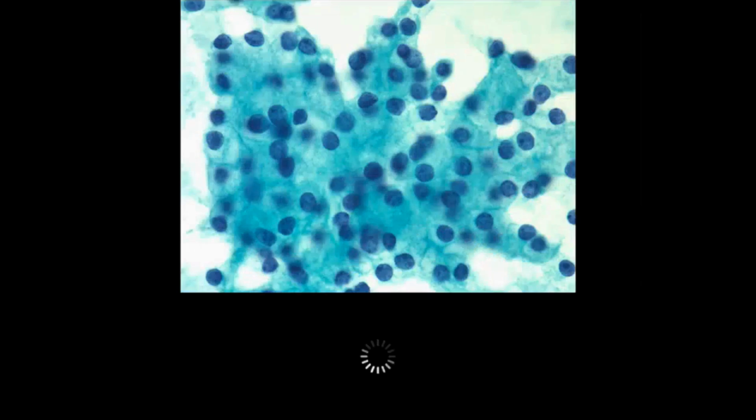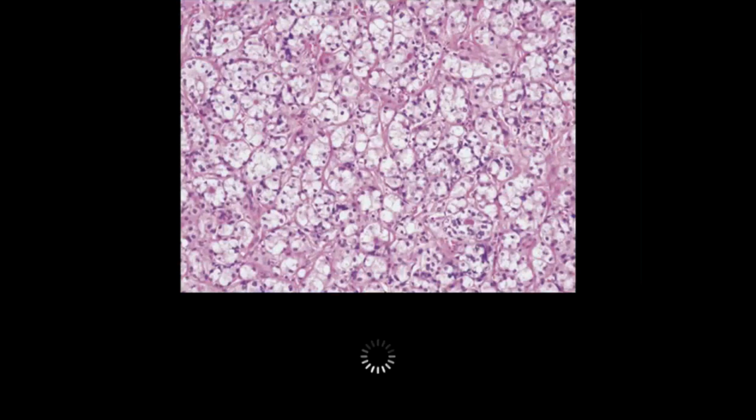And here we can see the papilloid groups of the atypical epithelial cells that do appear relatively bland, round nuclei with prominent nucleoli, and we have transgressing capillaries running through the groups. This is a picture of acinic cell carcinoma showing the typical cytomorphological features resembling benign acinar cells, but the architecture is wrong for that. It is on a histological sample.